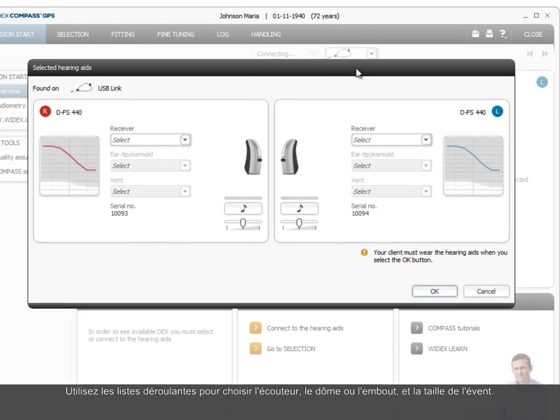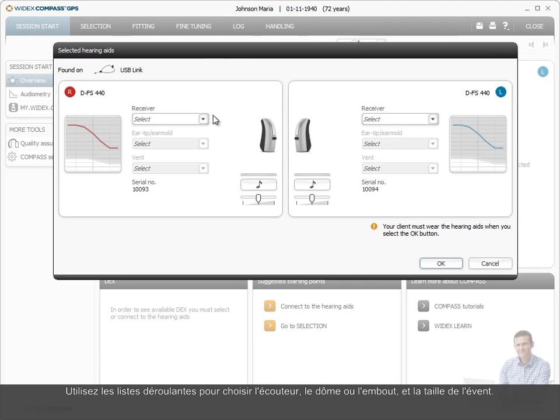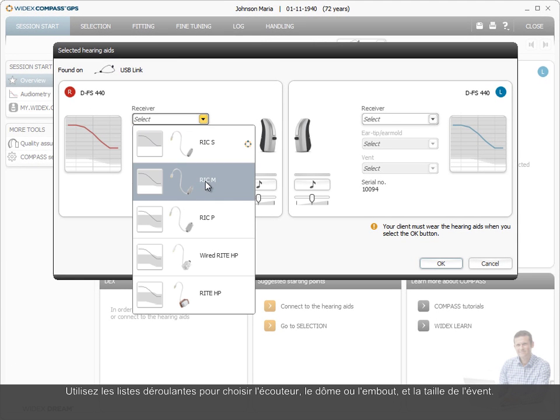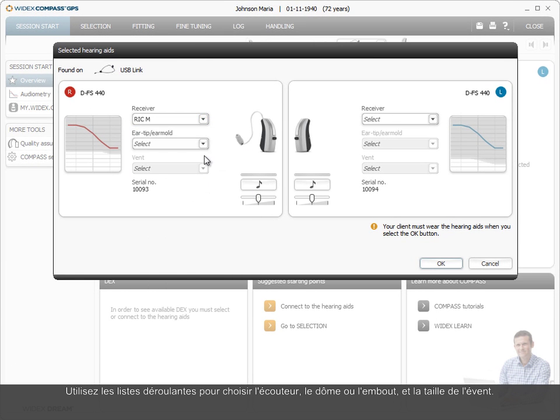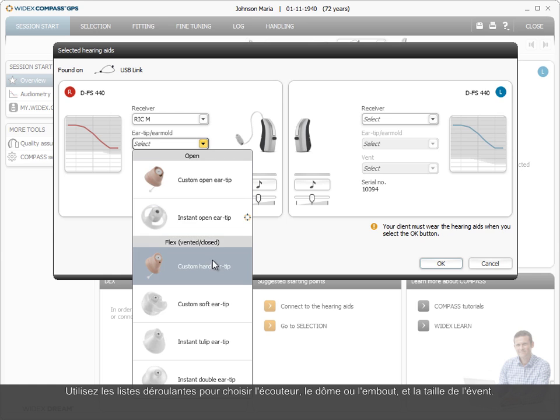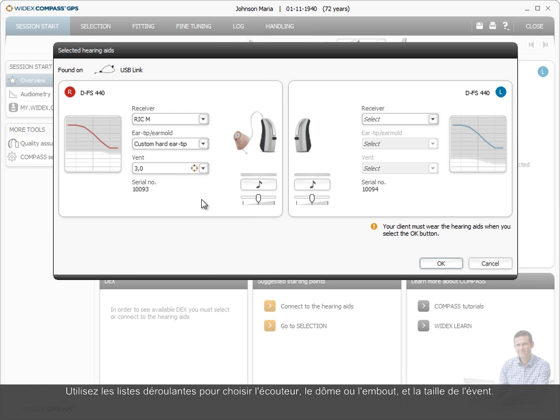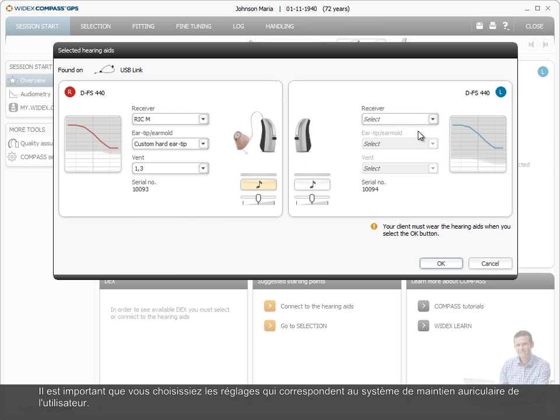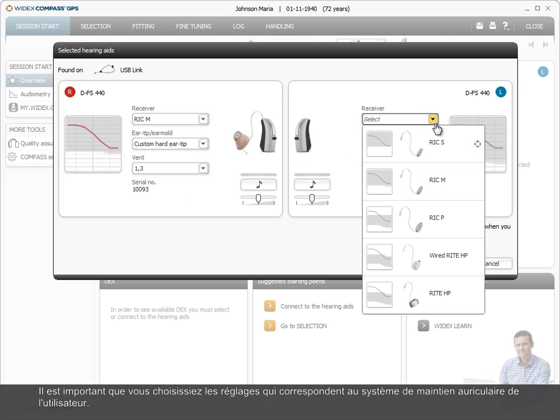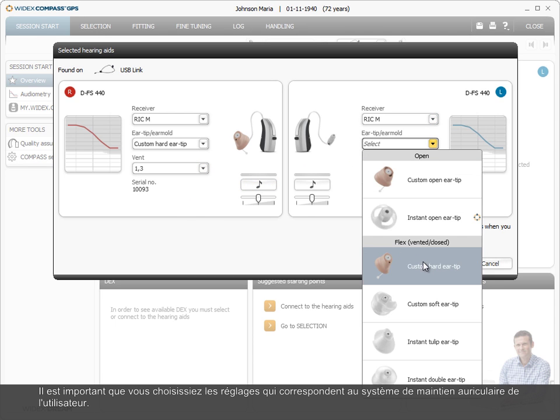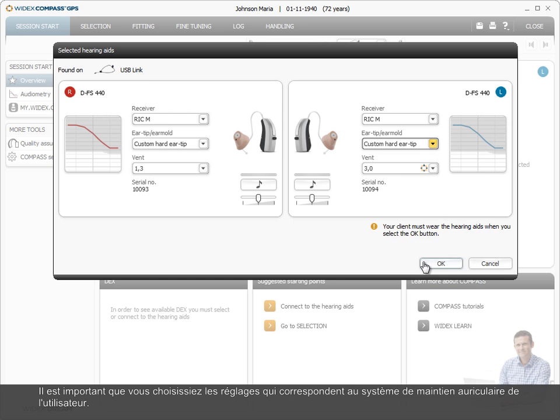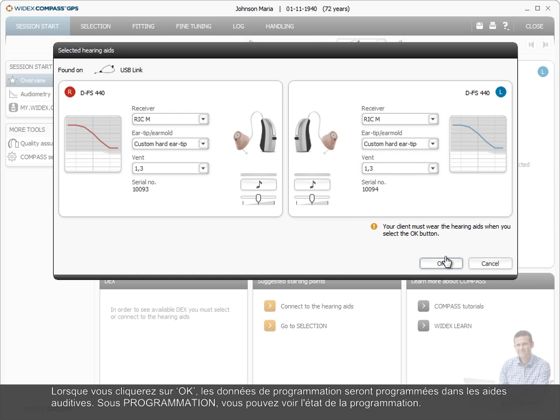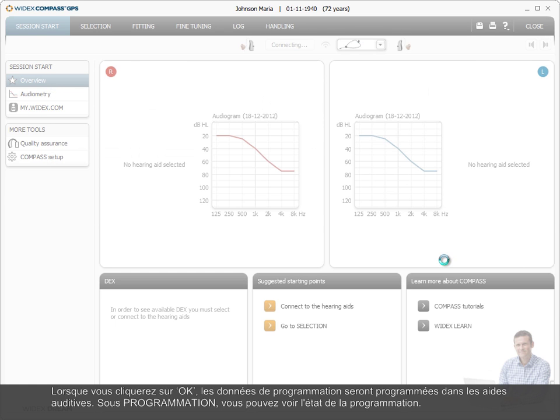Use the drop-down list to choose the receiver, ear tip or ear mold, and the size of the vent. It is important that you choose the settings that match the hearing aid user's actual ear set. When you click OK, the fitting data will be programmed into the hearing aids.